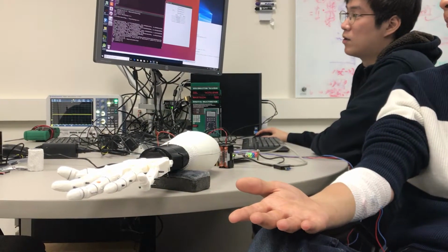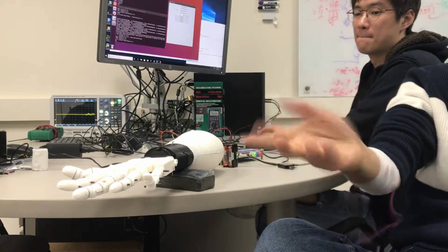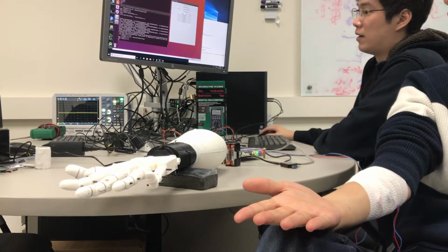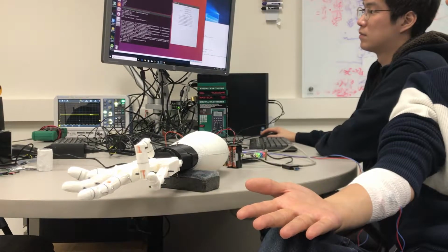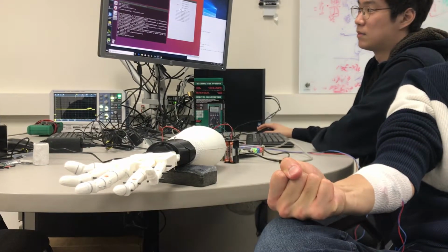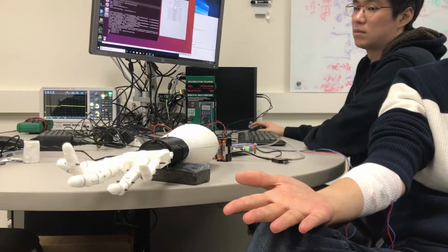So after we're done training, we're going to classify his gesture, and then I'll put that same gesture on the robotic arm. Wrist motion. The ring. The relax. The hold. Relax.